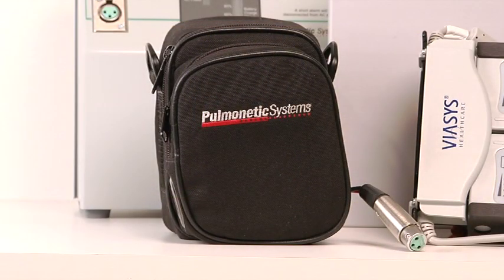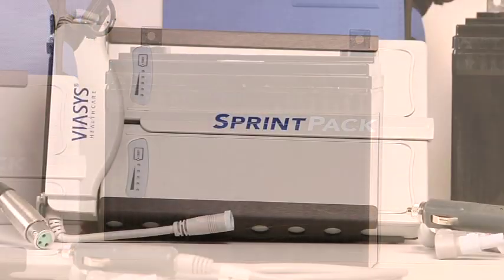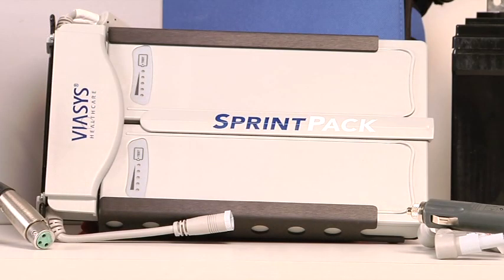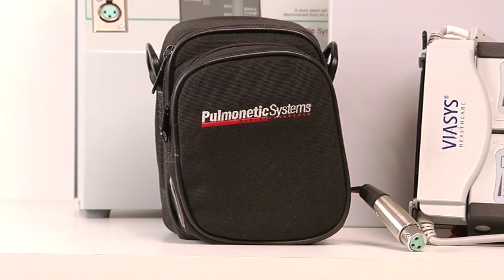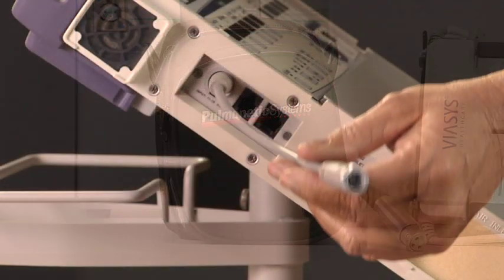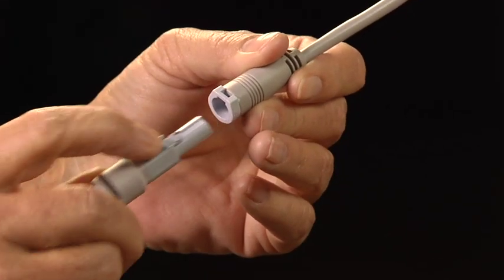Several external battery options are available from Pulmonetics systems. Each battery system has its own requirements, so be sure to read those instructions carefully before using the external battery with the LTV. The cables for LTV-compatible external battery systems are pre-wired and properly terminated to ensure safe connection to the LTV series ventilators. To run the ventilator from an external battery, connect the power connector on the battery cable to the power port pigtail connector on the left side of the ventilator.